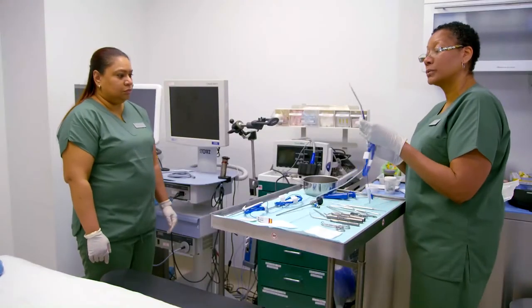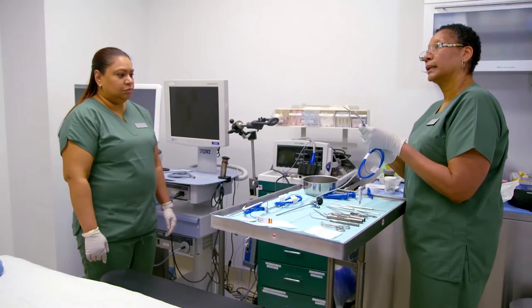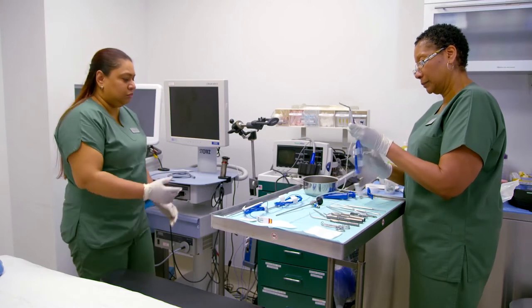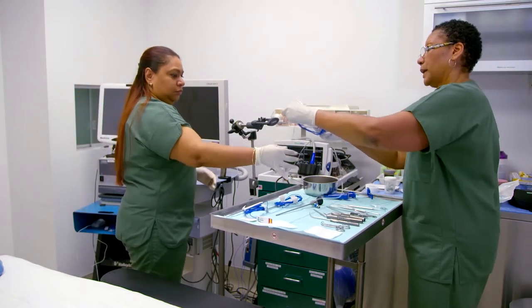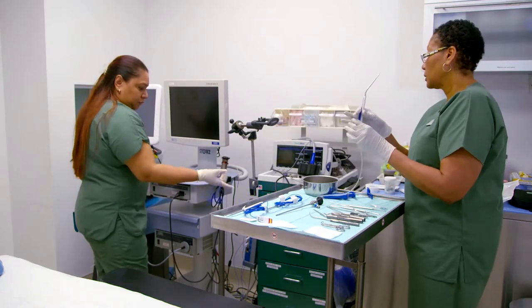First one she's going to use is a sphenoid. I attach it to the sphenoid balloon. Pass it off to Maria, and she plugs it in.